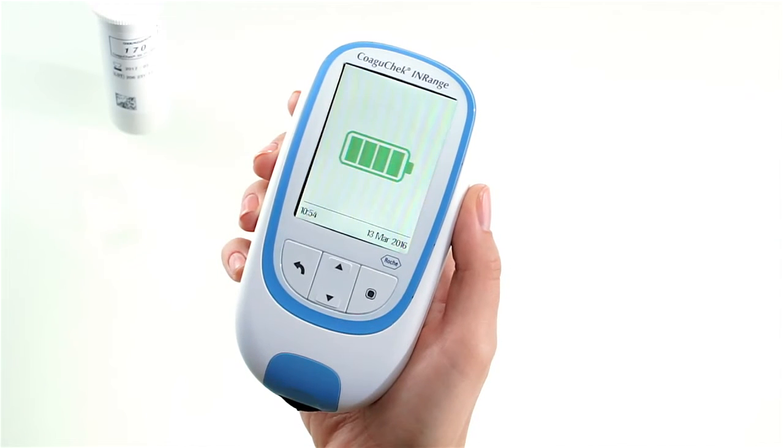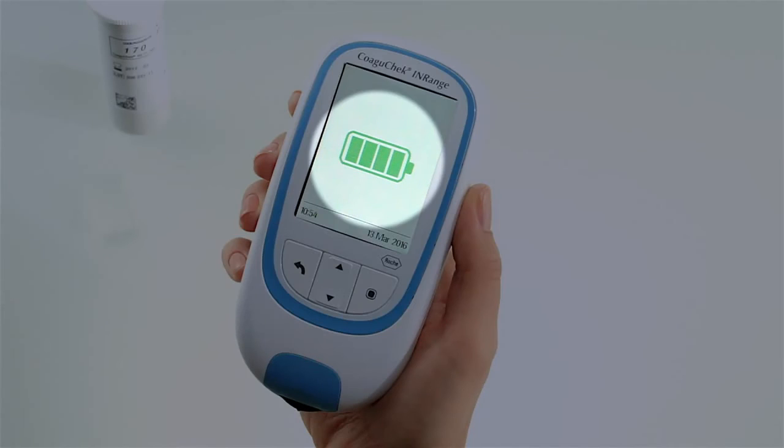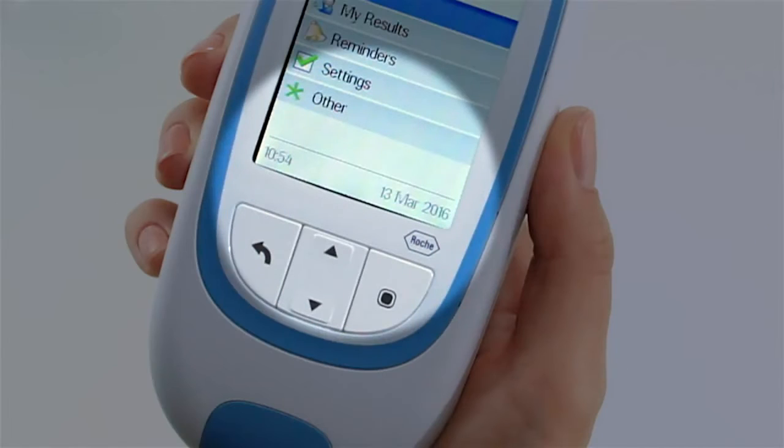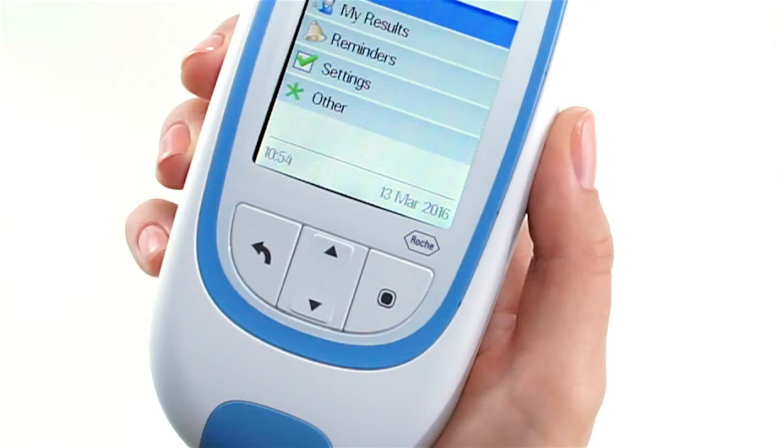If the meter displays a battery low message, you can still perform up to three tests. Remember to replace the batteries as soon as possible. Check that the time and date are correct, and if necessary, re-enter the time and date.